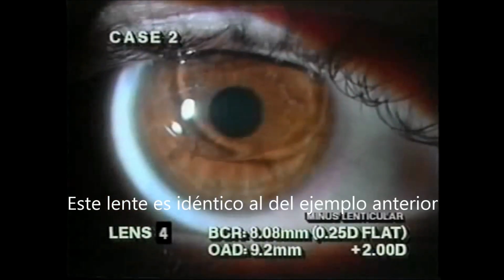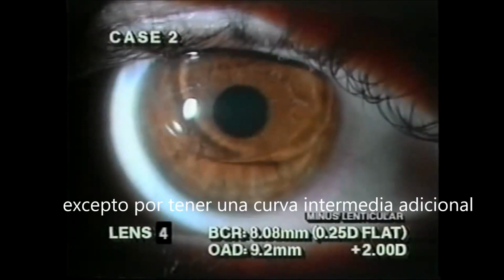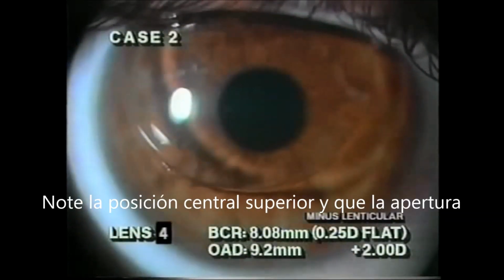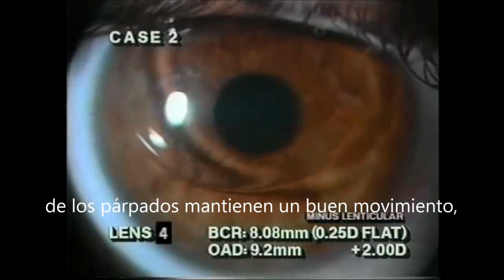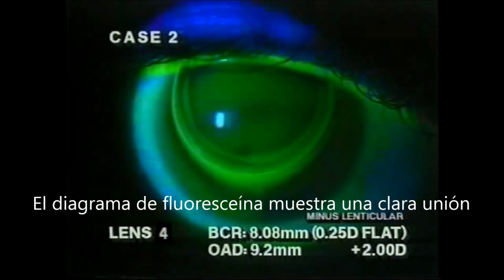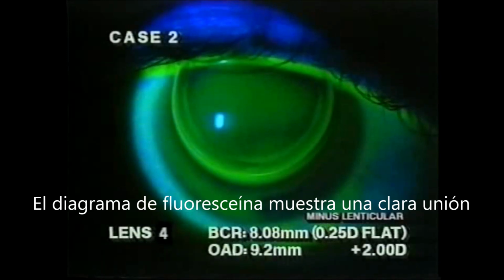This lens is identical to the previous example except for the addition of a minus lenticular edge design. Notice the superior central positioning. The thicker edge allows the upper lid to control lens movement. Viewing with fluorescein, the lenticular junction is clearly observed on the front surface.